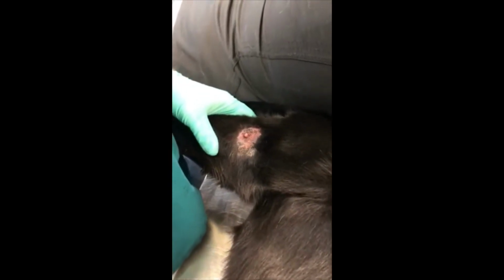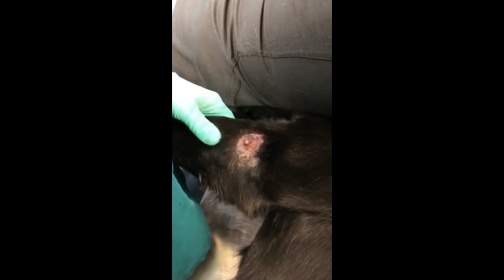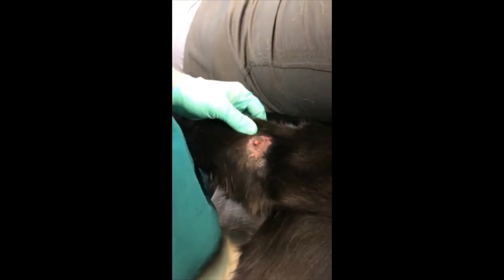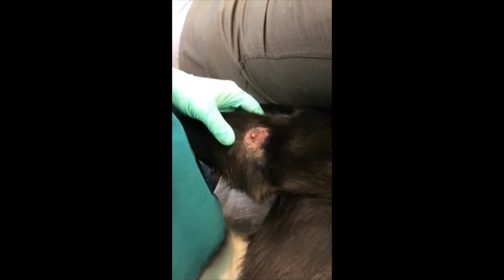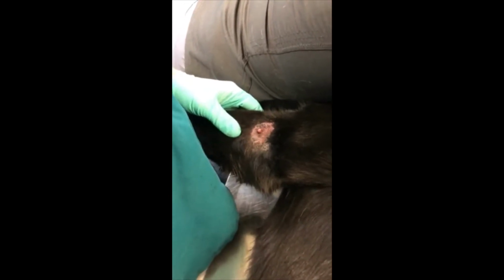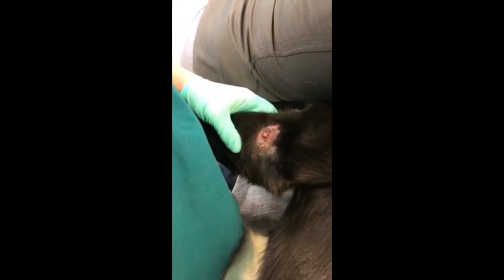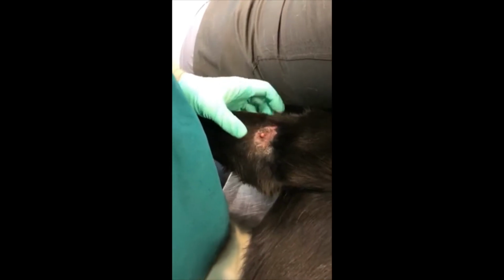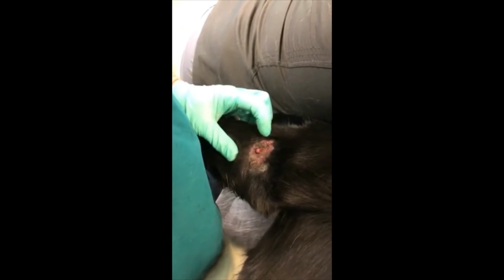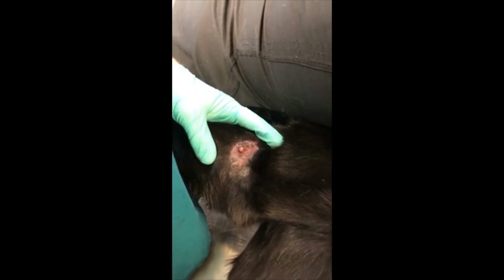This is Cooper. He's a 9-year-old Labrador mix. He has a small dermatologic, probably fibroma, on his left lateral cubitus. Basically, this is mostly aesthetic. I indicated to the owner that we probably should leave it alone. The owner requested it be removed as a result of the dog bothering at it, and specifically the owner last night with tweezers trying to remove what he thought was a tick made all these small holes in the skin just adjacent to it. So we're going to cryo this lesion today.